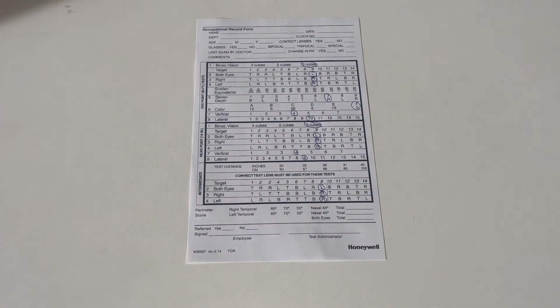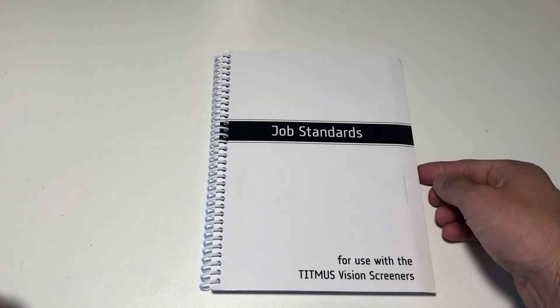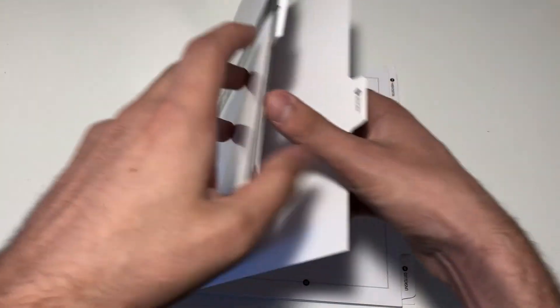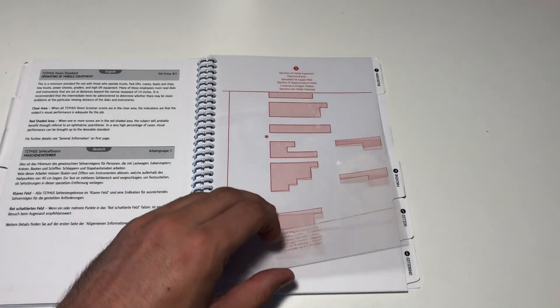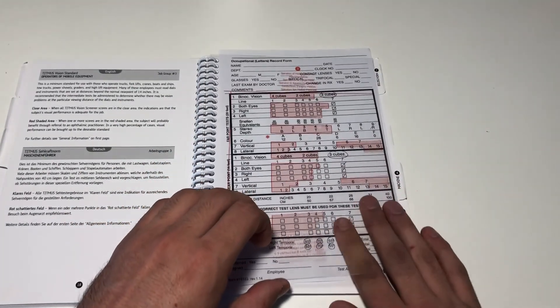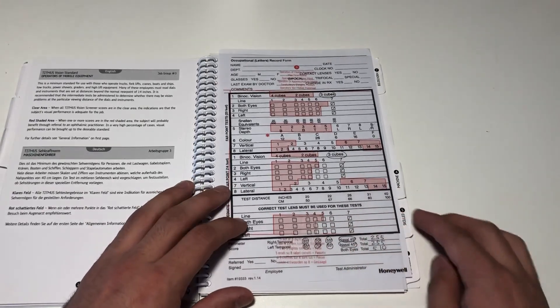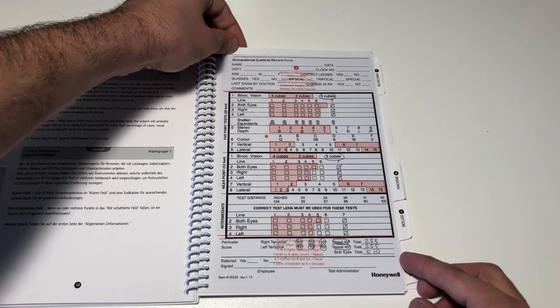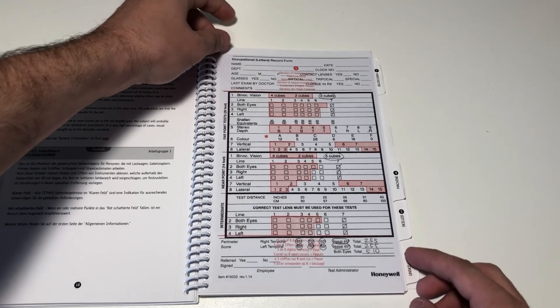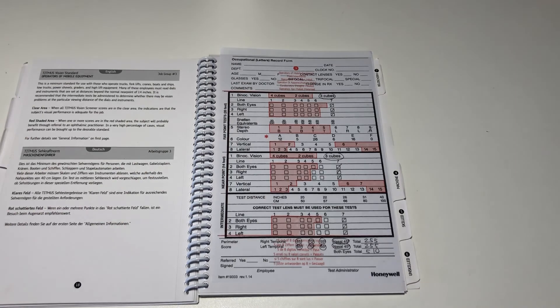After completing this, the patient has finished the test and may be excused. Compare your record form to the proper section of the job standards book. If any of the results land in the pink areas of the overlay, it may be indicative of a vision issue. Do not attempt to diagnose the patient yourself — refer the patient to an ophthalmologist for further diagnostic tests.